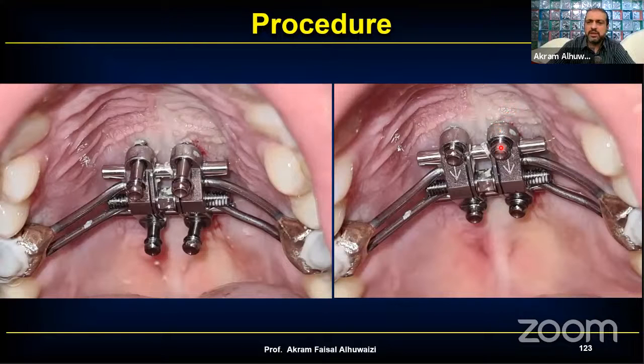But the thing is, should we stop? Should we continue as we pierce the nasal mucosa? Well, basically, we're dealing with just piercing the cortical plate. And finite element studies have shown that if you've pierced the cortical plate of the nasal cavity, that's enough. You do not need to push the screw all the way up. Just piercing the cortical plate of the nasal cavity is enough.